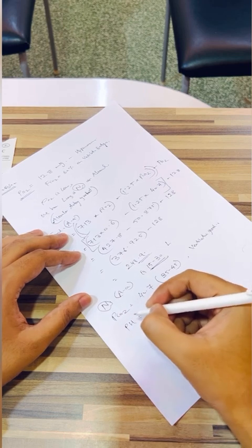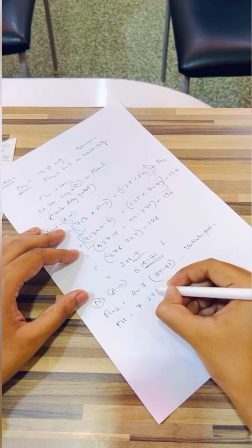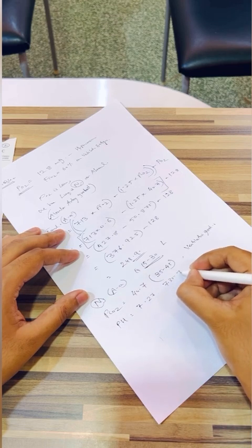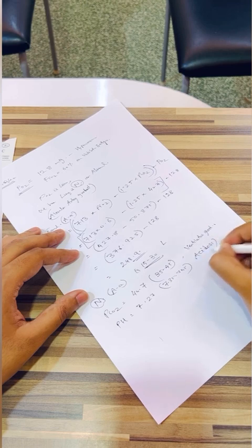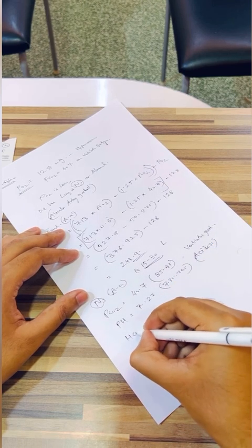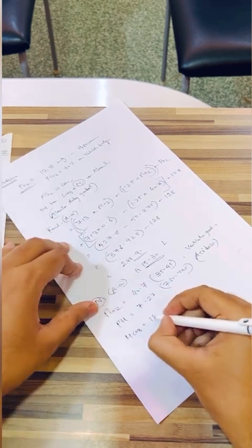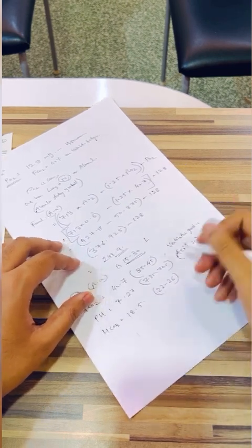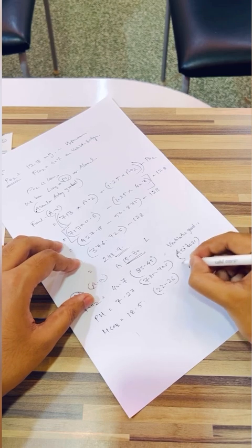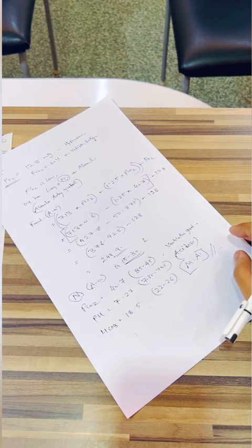Coming to the pH, it's 7.27. Normal is 7.35 to 7.45. So obviously it is acidosis. And the last thing is the bicarb, and the bicarb value for the patient is 18.5. The normal is 22 to 26, so it is less than 22. So obviously it's a metabolic acidosis. So far we have come to a conclusion that it is a metabolic acidosis.